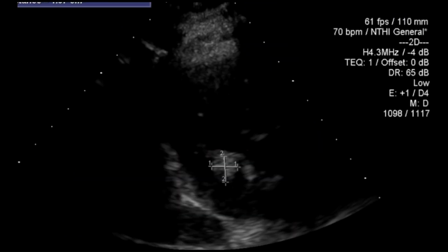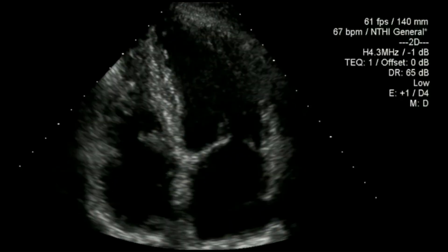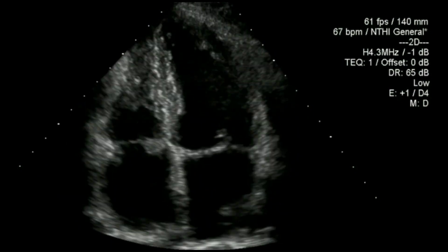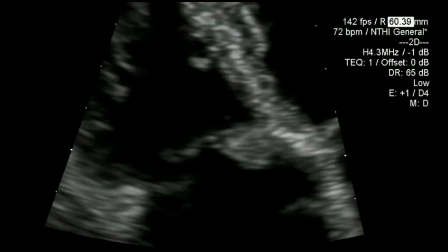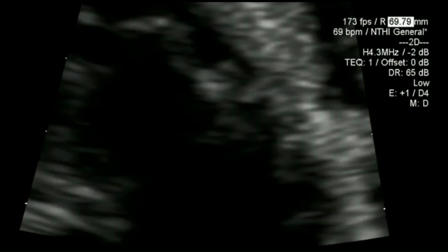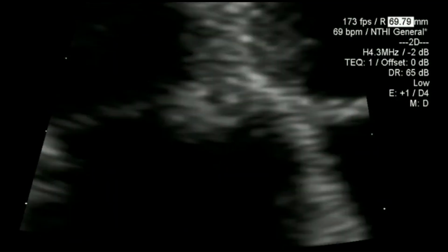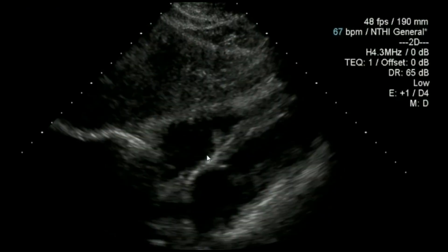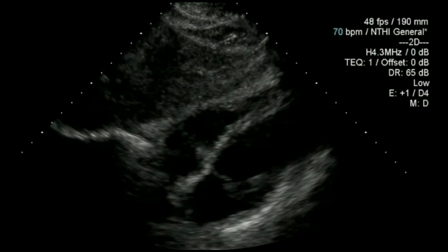And so the mass is approximately about a centimetre by a centimetre, so not that large at the current time that we're seeing. And then from the 4 chamber view, it can be seen very clearly attached to the leaflet just there. This case also ended up being surgically resected, as it was decided it was worthwhile to do. So she ended up unfortunately having a second surgical procedure to remove this one. And even from the subcostal view, it can also be seen as well.